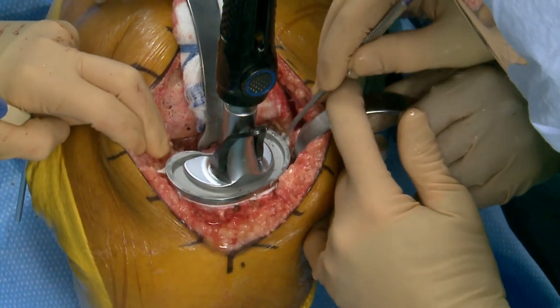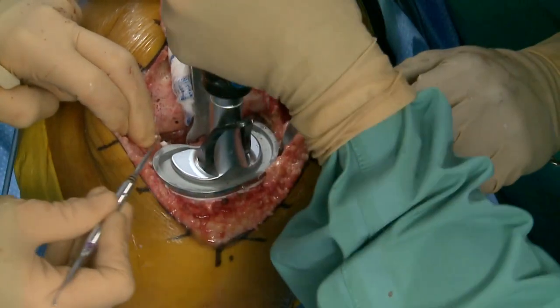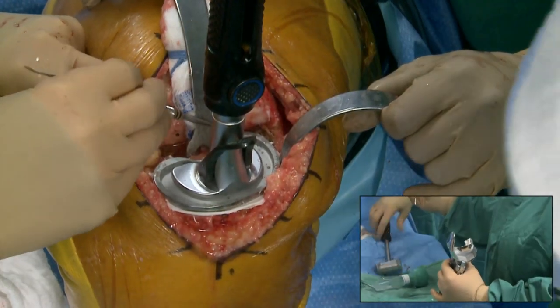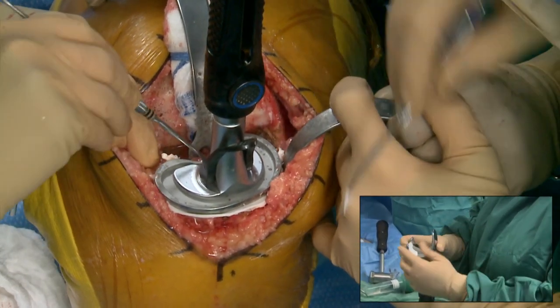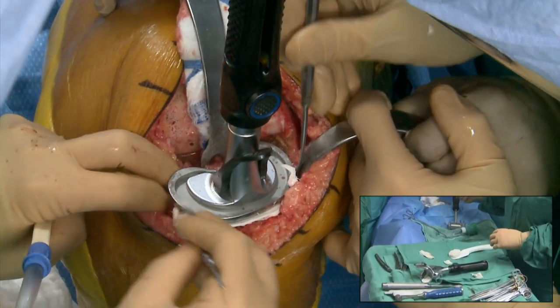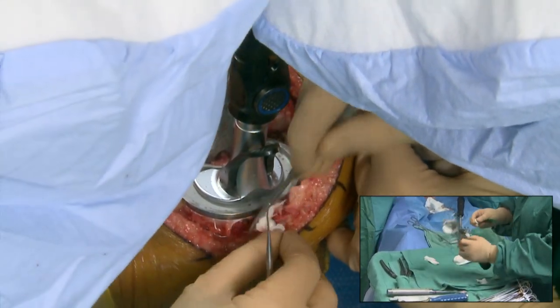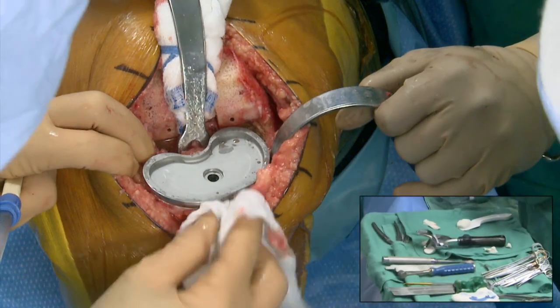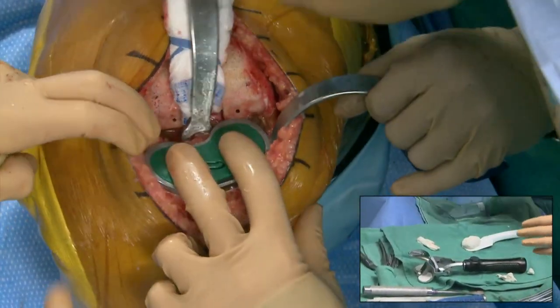This is definitely the part of the case where you hear about cementless knees and say to yourself that sounds really attractive — because this is probably the most tedious part of the case, and also the one that gets everybody the most nervous. Cement frenzy. I definitely have some cement anxiety — guilty of that.